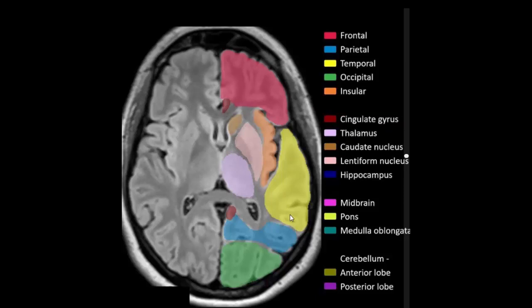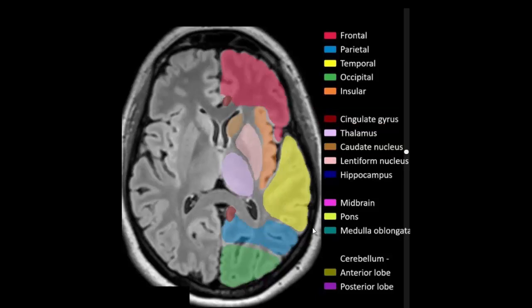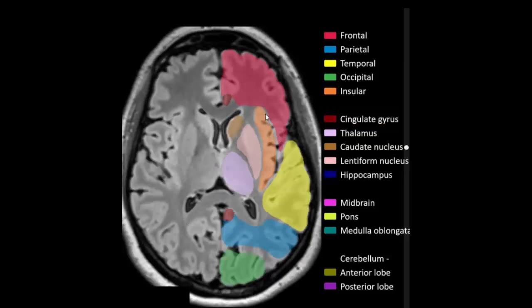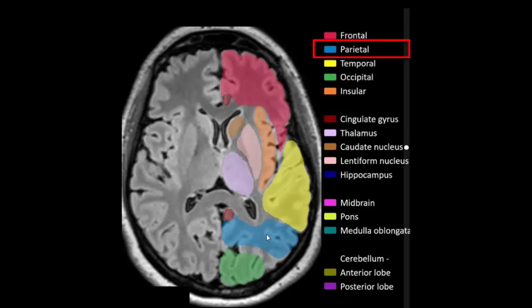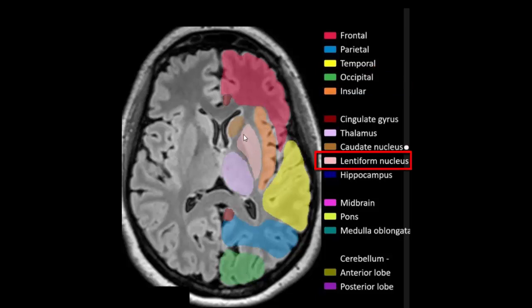Frontal lobe, temporal lobe, parietal lobe, occipital lobe, insular cortex, lentiform nucleus, thalamus, head of caudate nucleus.